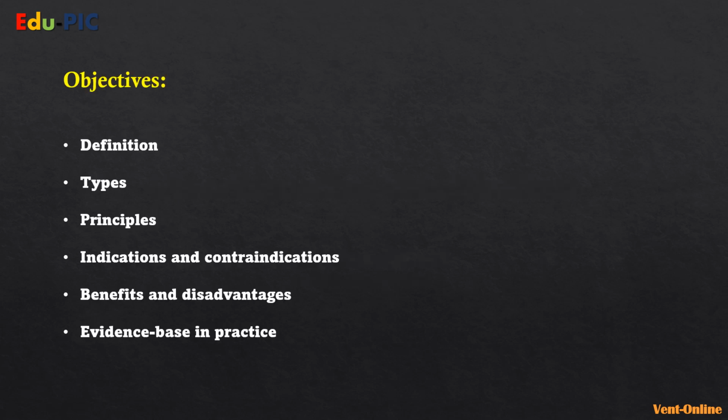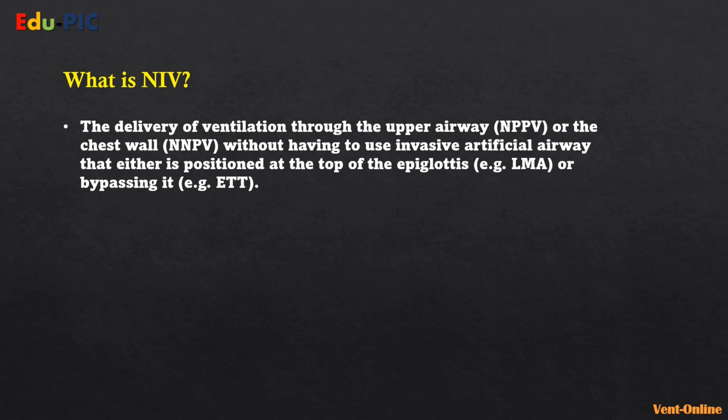So, we're going to try to cover the definition, types of non-invasive ventilations, principles behind them, indications and contraindications, also benefits and disadvantages, and we're going to try to lightly touch base on the evidence base in practice. So let's start with the definition.